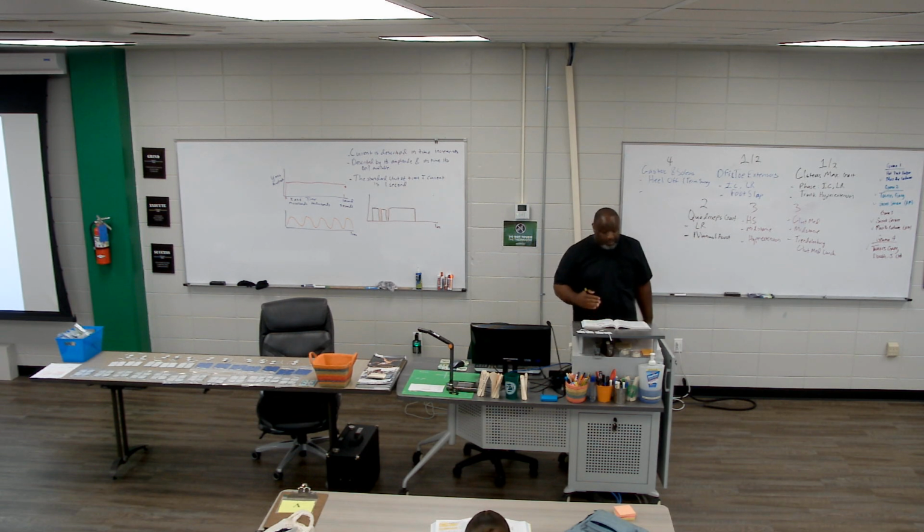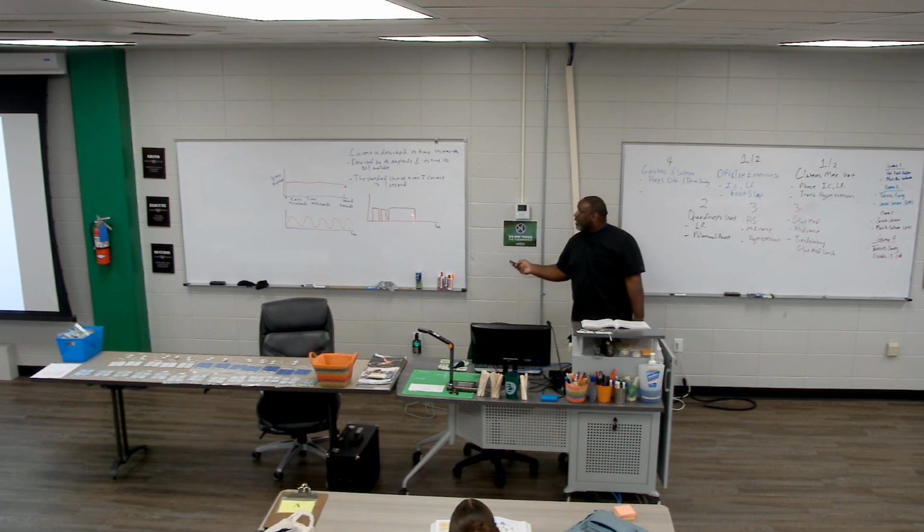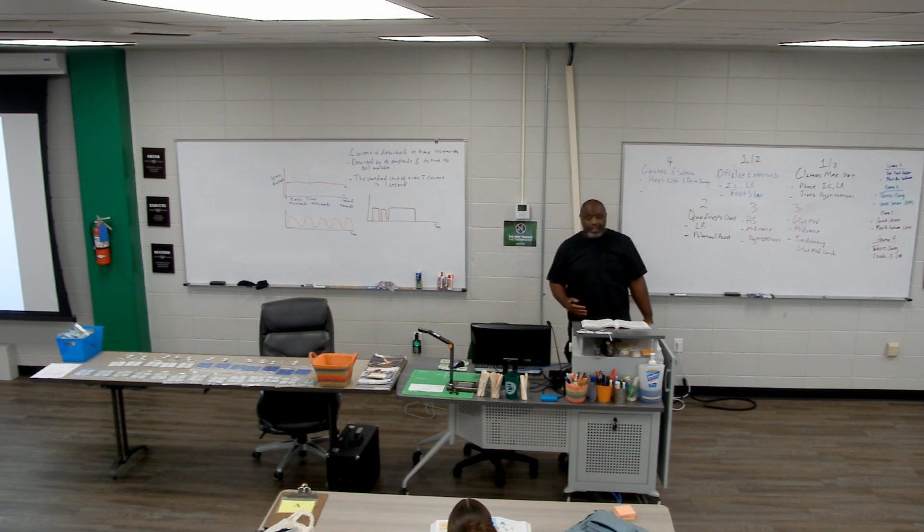So it says pulses are going to be classified by how many phases they have. Unlike direct current, which doesn't have but one phase, going in one direction, or alternating current, which will have two phases, above and below the isoelectric line, a pulse current can either be monophasic, biphasic, or polyphasic.